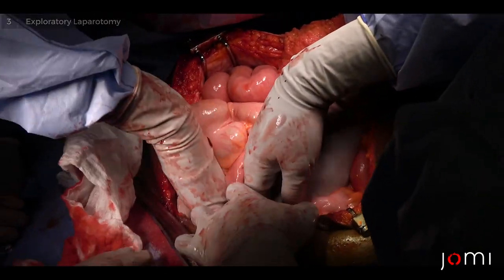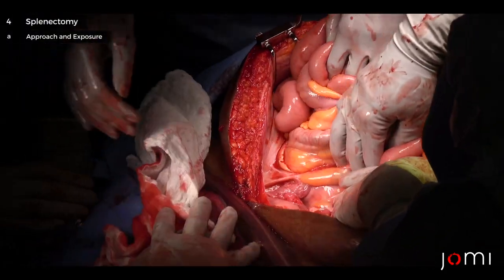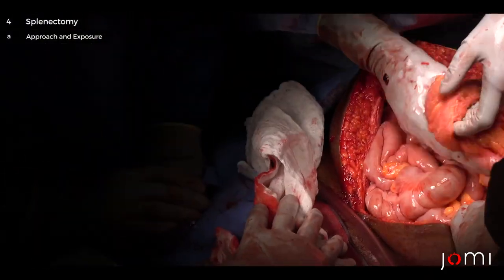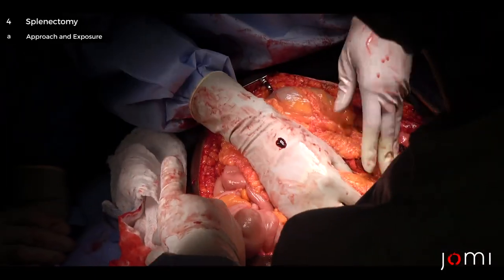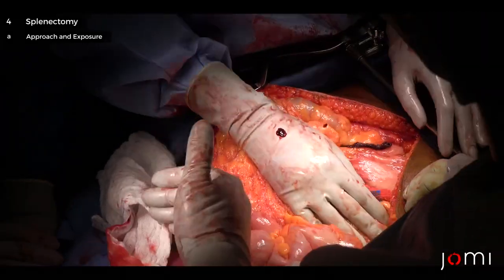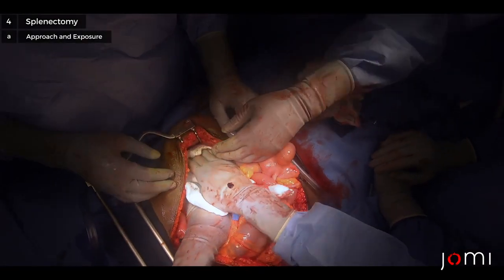All right, so we've done our initial exploration. The spleen is busted on CT scan. There are some liver lacerations but they're not really clinically significant. We checked for RP hematomas — nothing there. We ran the bowel — nothing there. So now our plan of attack is to get this spleen out.